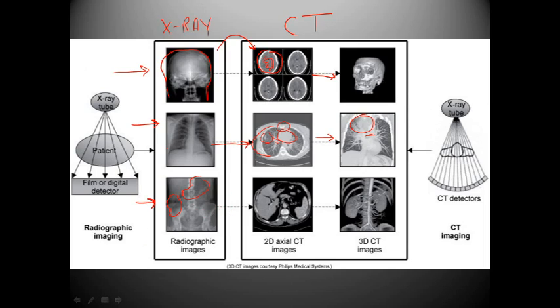We can see the bony anatomy, and we can catch a rib or two coming in, but pretty much that's all we can do. KUBs really are kind of up in the air about what you may see or what you may not. And we also know that we can see sometimes the outline of the kidneys and the liver borders and things like that, but grossly it's inefficient because you really can't see anything else that's going on.